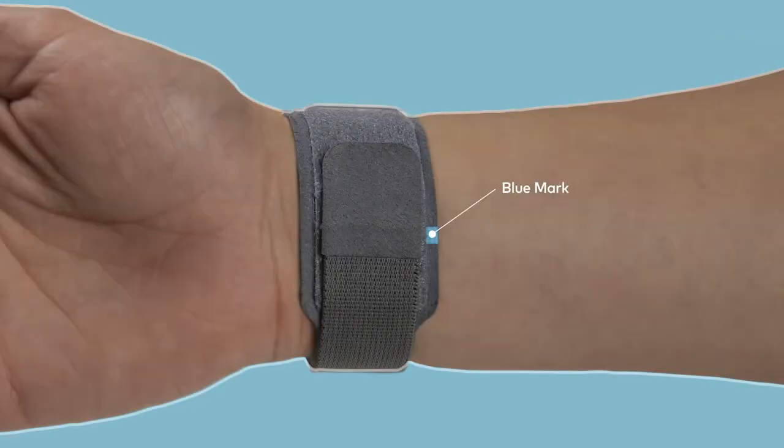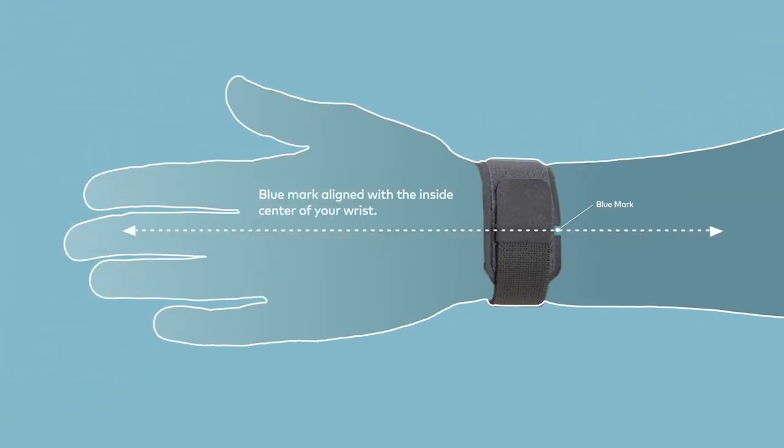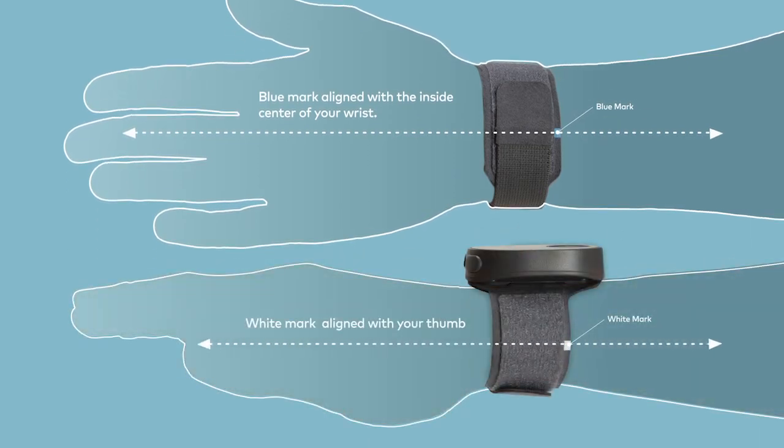Now, tighten the Velcro strap. Be sure that the blue mark on the strap is aligned with the inside center of your wrist, like this. The white mark should be aligned with your thumb and the strap tight enough so that the electrodes in the band are flush with your skin.